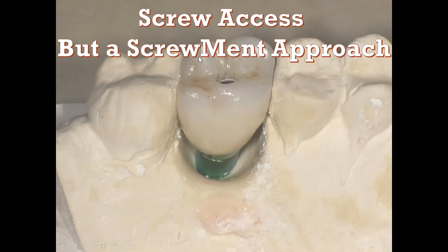then I take the separate crown and I put it over the abutment. If I have to adjust the contacts, I adjust the contacts. Once the contacts are down, I take an x-ray to verify full seating. Then I check the occlusion. After everything's set, then what do I do?